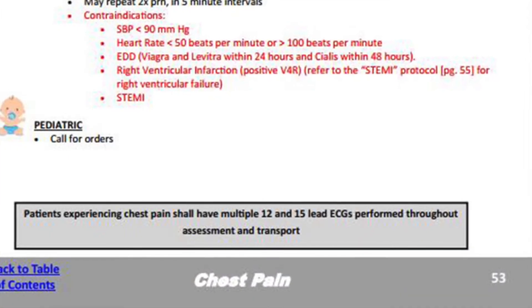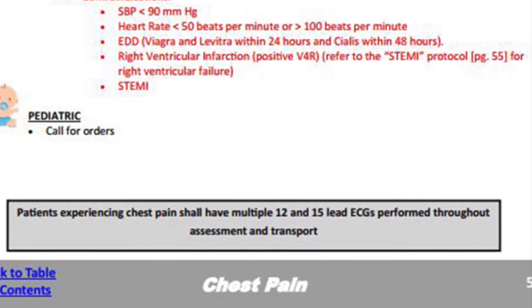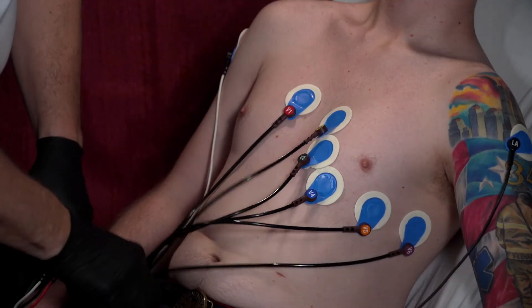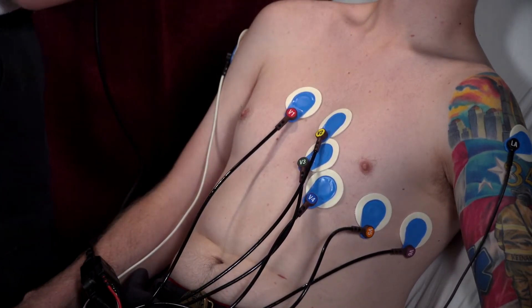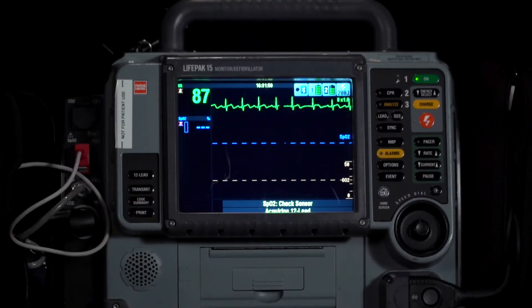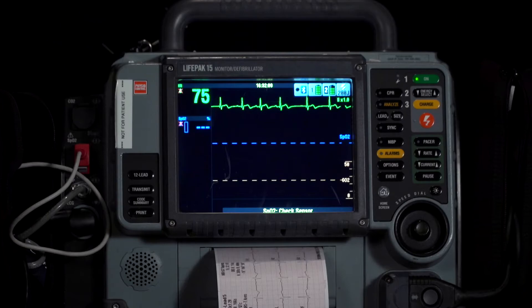Per page 53 of the chest pain protocol, patients experiencing chest pain shall have multiple 12 and 15 lead ECGs performed throughout assessment and transport. Start by obtaining the 15-lead EKG, then obtain the 12-lead EKG and leave the patient connected to the monitor in the standard 12-lead configuration. The LifePak 15 will continually monitor the ST segment and compare it to the first one you ran. If it notices a millimeter of change at any point, it will automatically print out a 12-lead.